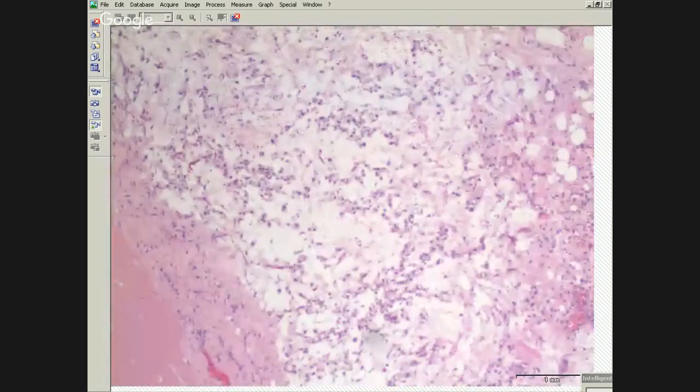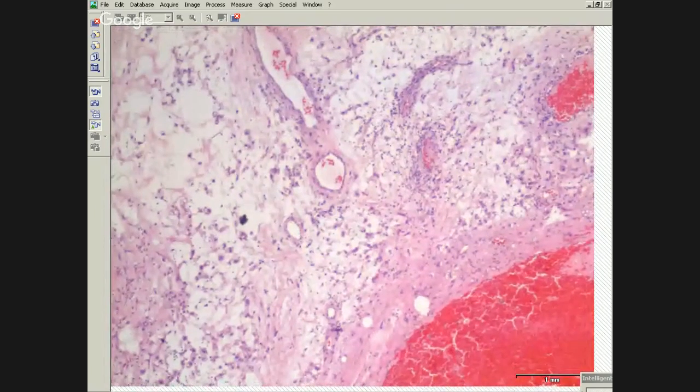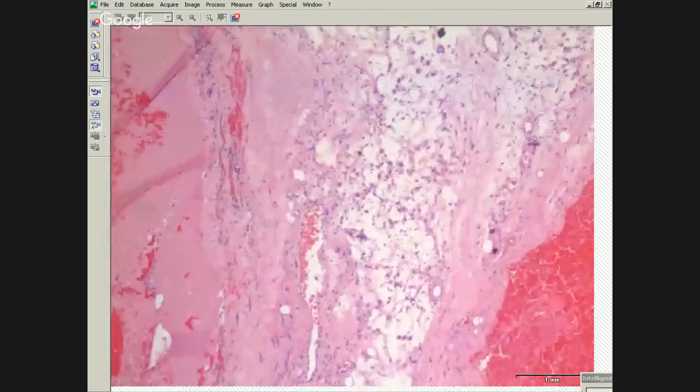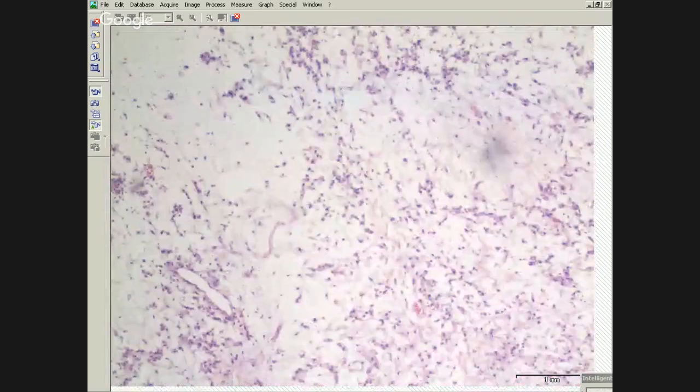When you get liposarcoma as a pleural primary, the myxoid subtype is the most common. So this is just a reminder that really anything can happen in the pleura, and you want to think about your sarcomas and your soft tissue tumors in particular. There's really only one good study, a series of liposarcomas of the pleura, so they're pretty uncommon. Myxoid liposarcoma in general is going to have that chicken wire vascular pattern, so that's also a clue here.